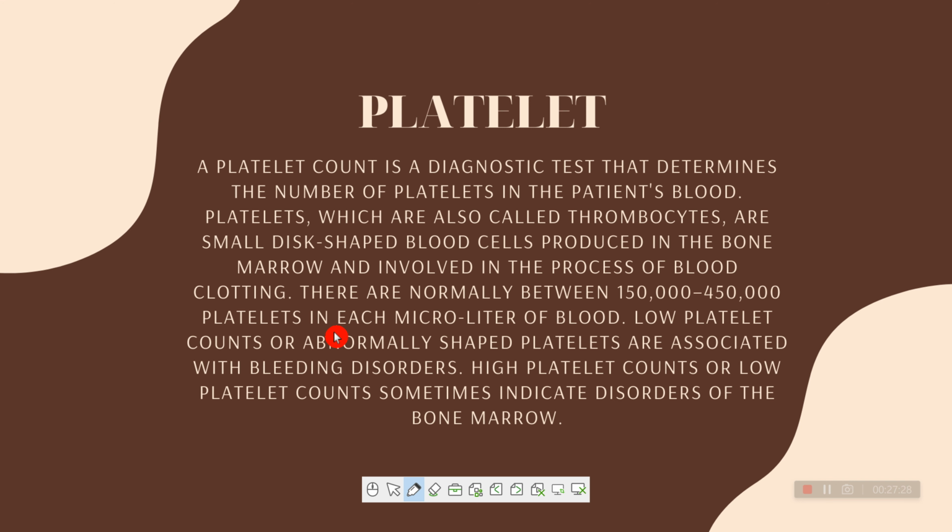Now the platelet count. So platelet count is another blood cell count performed in the patient's blood. Platelets are also called thrombocytes. So the platelet counting test can also be called the total thrombocyte count or the total platelet count. Alright, so why is platelet count performed? Platelet count is performed to see if the person is normally having platelets or is suffering from any disorder or disease in which the platelet count is decreased.